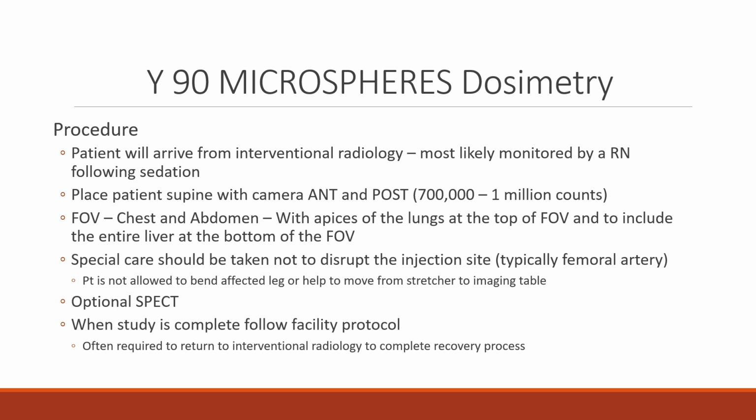Special care should be taken not to disrupt the injection site. Typically, this is in the femoral artery. Patient's not allowed to bend their affected leg, so you have to be really careful moving them and imaging them. It is optional to do SPECT or SPECT-CT. When the study is complete, you'll follow the facility protocol. Often it's required to return them to interventional radiology to complete the recovery process.